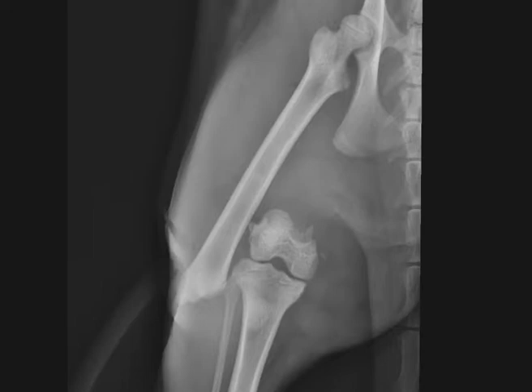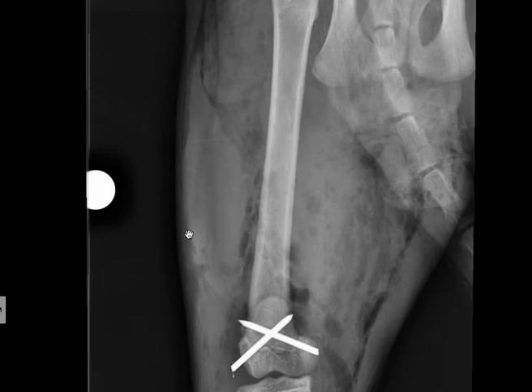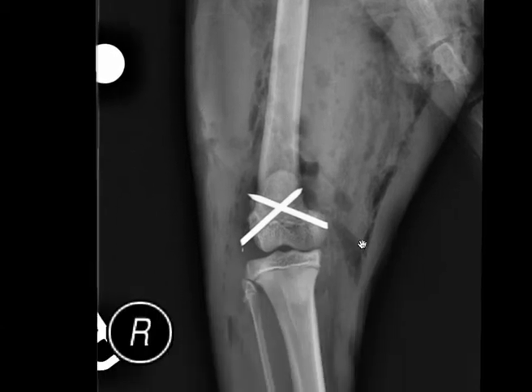Today's example is a follow up from last week. You'll recall that this young cat has a terribly displaced physeal fracture. Today, I can show you the postoperative study. Here you can see a craniocaudal view of the physis obtained after surgery. I will touch on a few points about postoperative use of radiographs to assess adequacy of fracture repair.